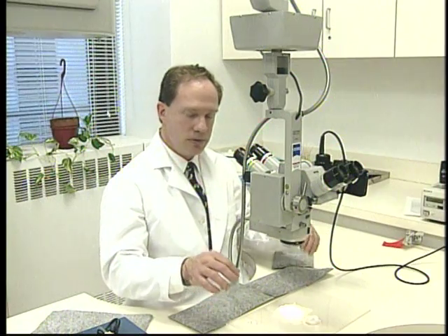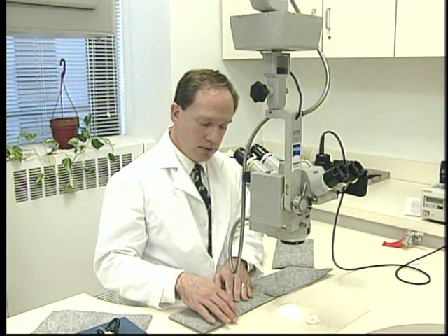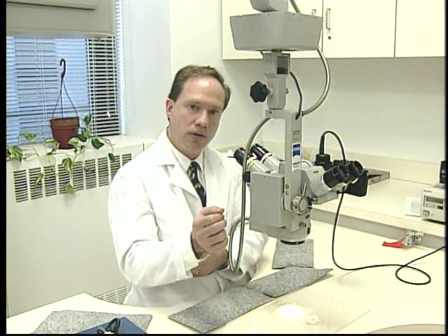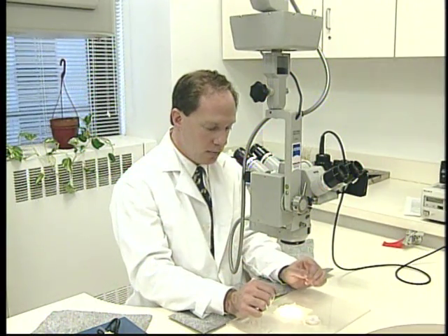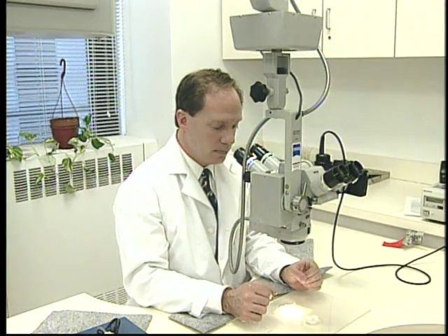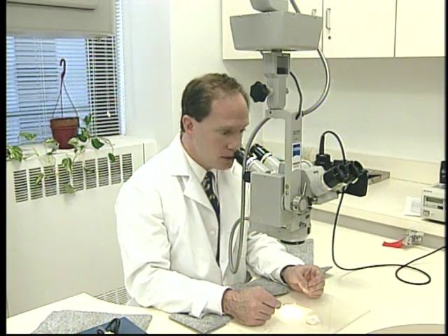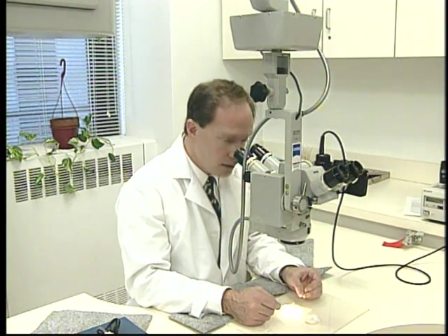You'd like your hands to be comfortably resting on the table. We usually use some padding so that your forearm is not resting on the sharp edge of the table, and your elbows should be comfortably bent. Basically, you want to make yourself as comfortable as possible because you may be doing a long microsurgical procedure during which time you can become more fatigued if you are not comfortably positioned, to say nothing of developing neck and back strain.